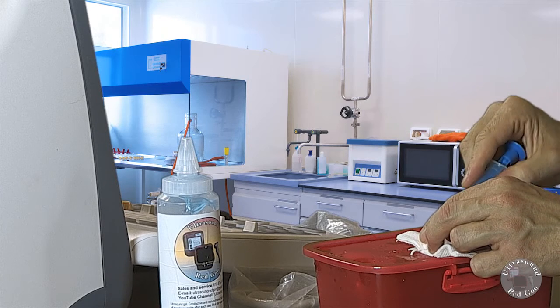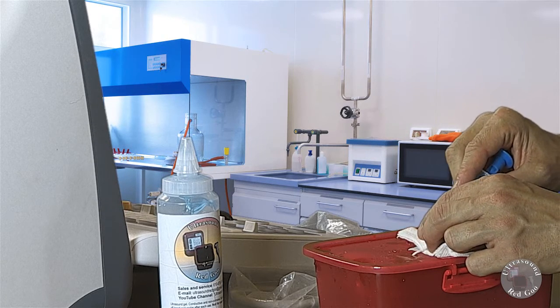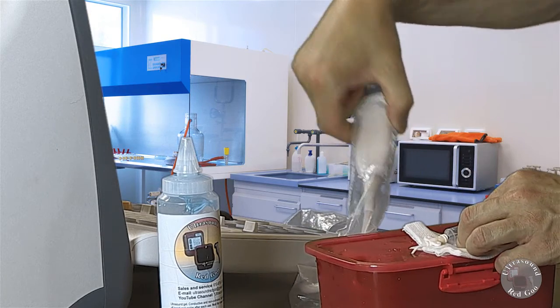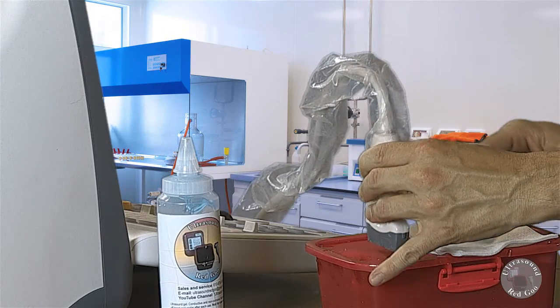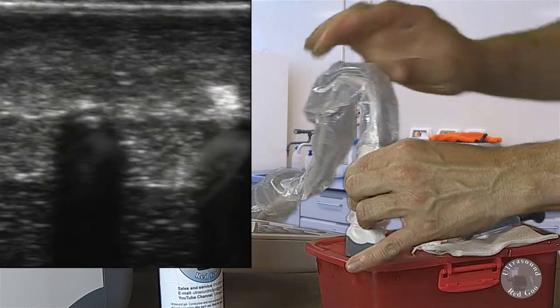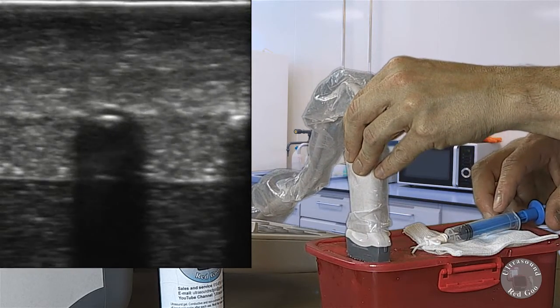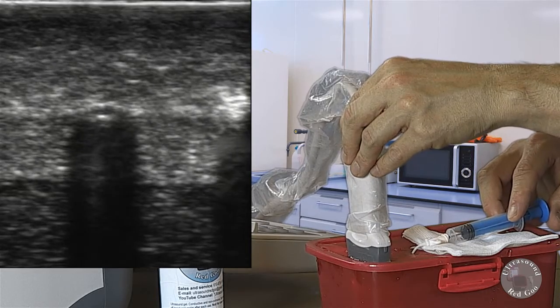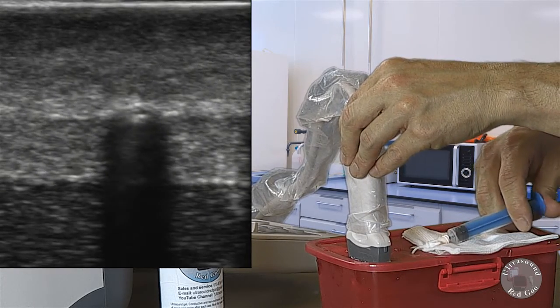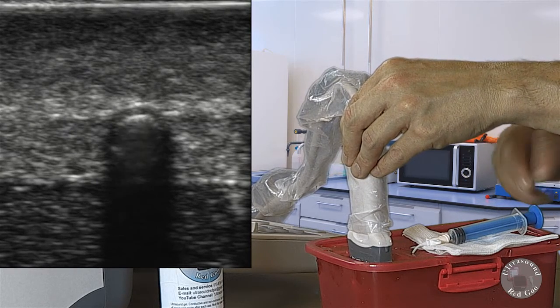I'm going to give myself a little bit of either air or liquid - saline is better, no dextrose containing solutions. I'm going to assess the tip of the catheter in the lumen, and I'm going to find it right there. When I find the tip of the lumen of the 20 gauge catheter, I'm going to give a little bit of an injection.